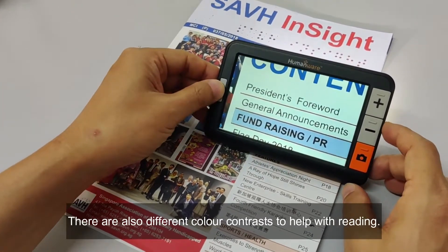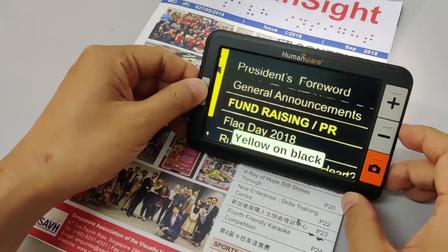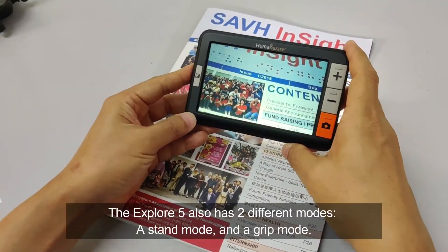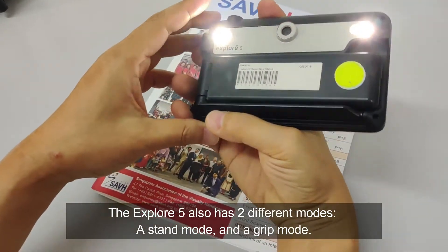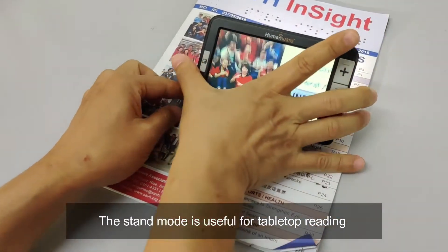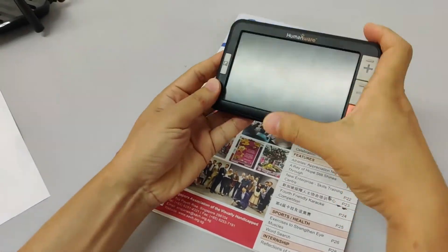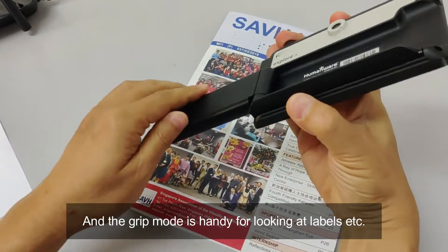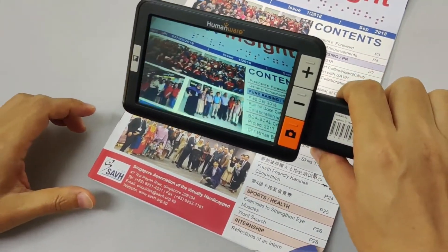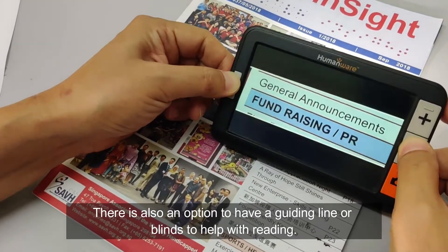There are also different colour contrasts to help with reading. The Explore 5 also has two different modes: a stand mode and a grip mode. The stand mode is useful for tabletop reading, and the grip mode is handy for looking at labels and so on.